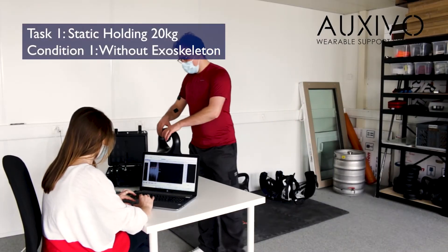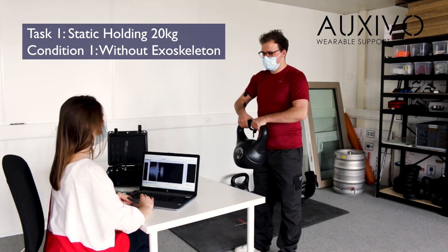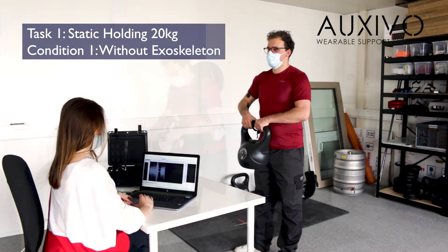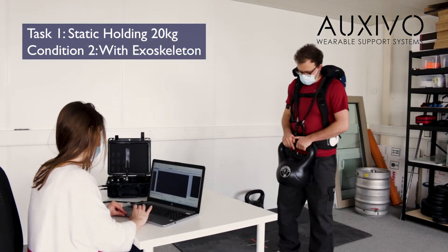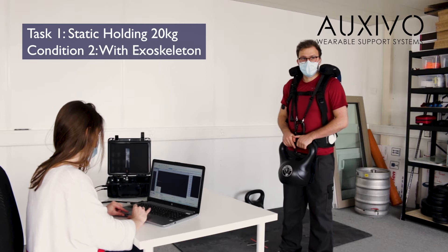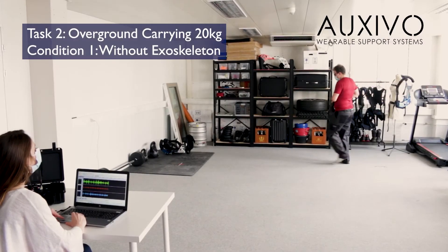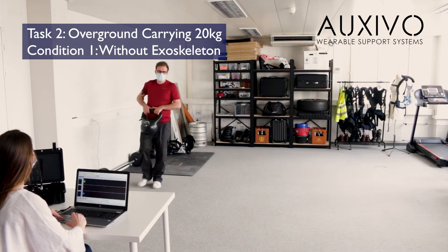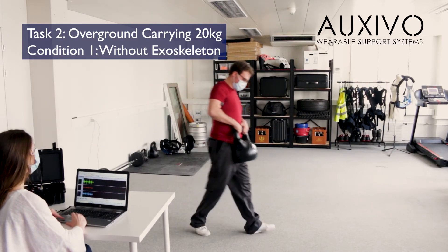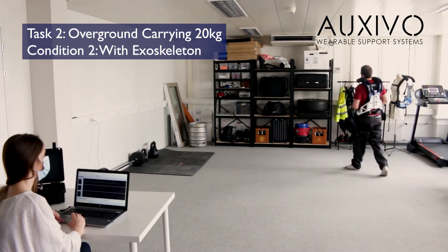Once the participant is prepared and instructed we can start with the measurement. We conduct a variety of tests during such an experiment. This time we tested static holding of a 20 kilogram load as well as carrying the load over ground. Each task is done without the exoskeleton and with the exoskeleton so that we can compare the muscle activity. What we expect to see is a reduction in muscle activity when using the exoskeleton. This shows that the physical workload is reduced.